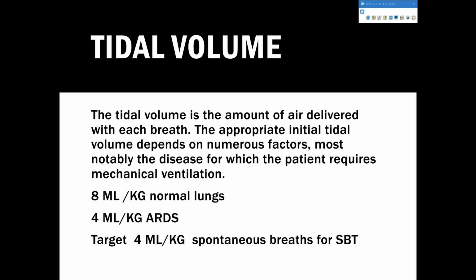Another thing I wanted to mention with that 4 mLs is when we are doing our spontaneous breathing tests, right? We're going to extubate our patient. It is not that they have to get to 300 or 400. I hear numbers just being thrown out. No, they have to be 4 mLs per kilo on their spontaneous. Okay, so half of what we would set.